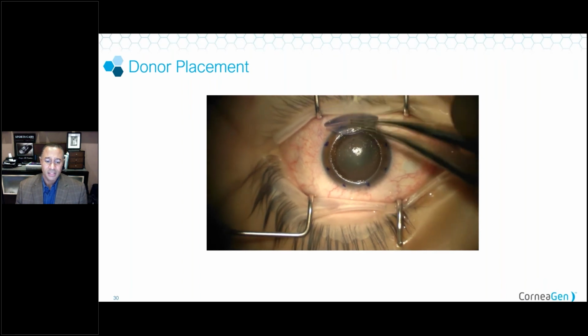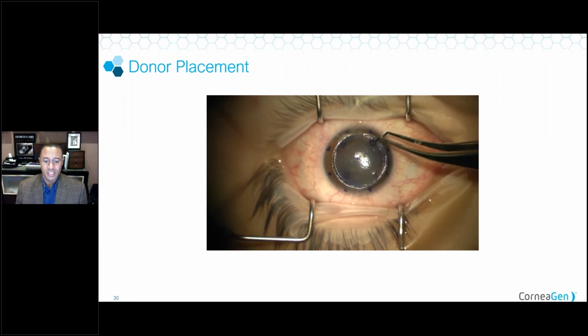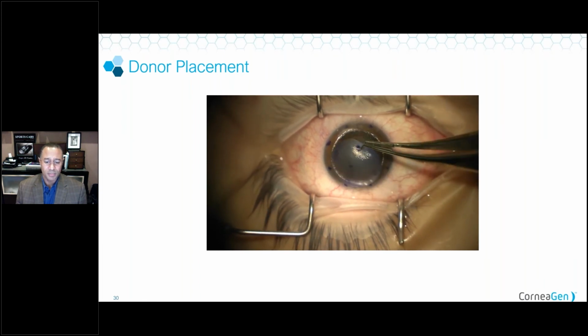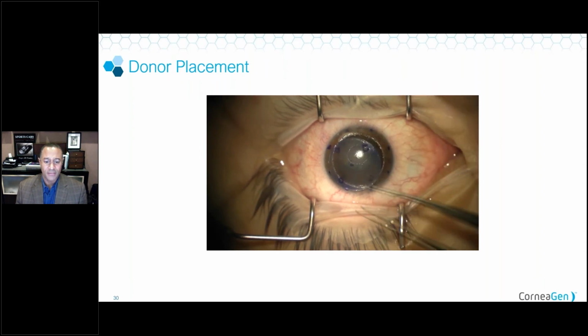In most cases, the cornea is very clear, particularly with this size of a graft, and we just orient it in place. In this particular example, I've intentionally left this graft a little bit off center and crooked and everything like that, so we can look at the OCT. And next slide.